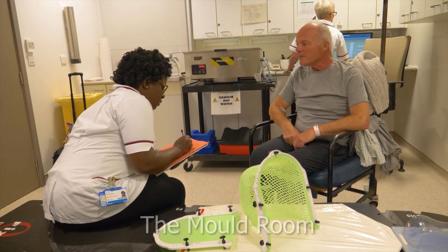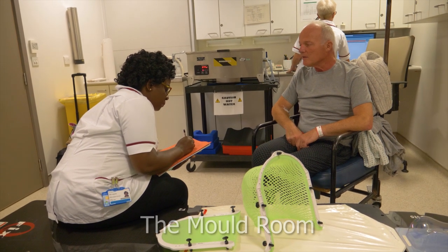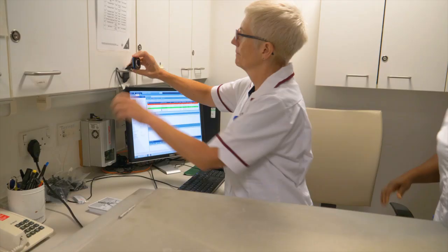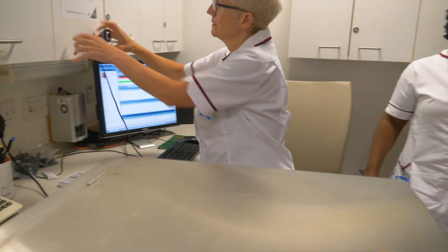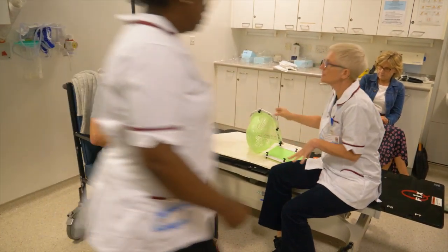Often our patients will be referred here to undergo radiotherapy and chemotherapy, and the purpose of this video is to show you what happens when a radiotherapy mask is fitted, then going on to the radiotherapy planning CT scan, and then showing you an actual radiotherapy session.